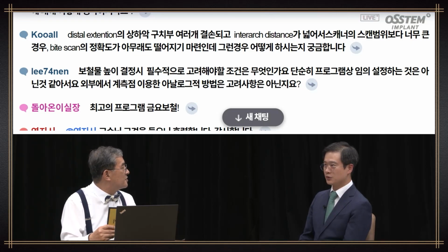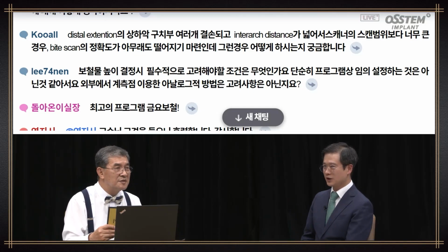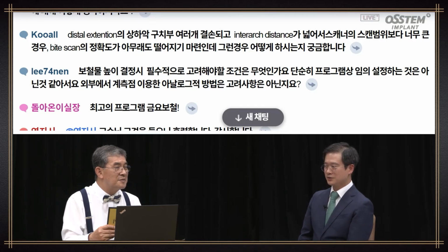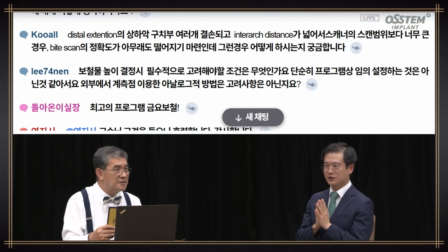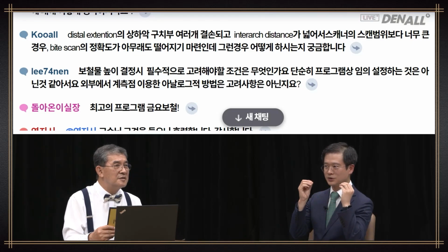Drawing a line between the canines and registering them on the wax rim. There are such ways. When you register bite, you can add straw to find the right balance. But these days, I primarily use the facial scan with oral scan. I reproduce the patient's face, so these analog ways are not imperative. Using oral scanning could be good.